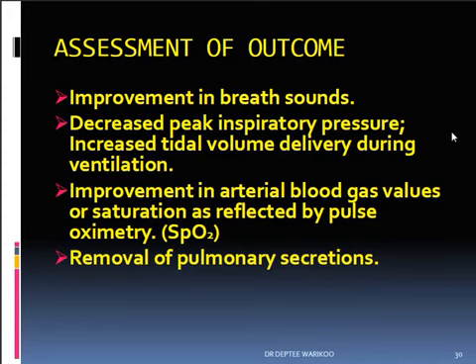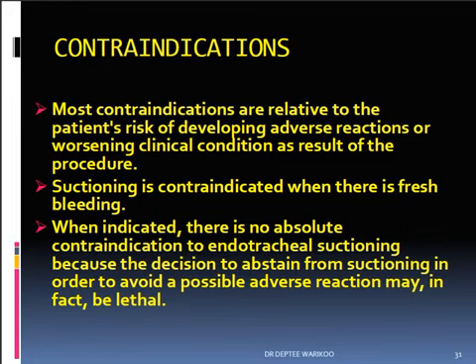It is decreasing the peak inspiratory pressure. Increased tidal volumes could be seen delivered during the ventilation. You could see improvement in the arterial blood gas values or saturation as reflected by pulse oximeter. And you could also see removal of the pulmonary secretions increase after suctioning.